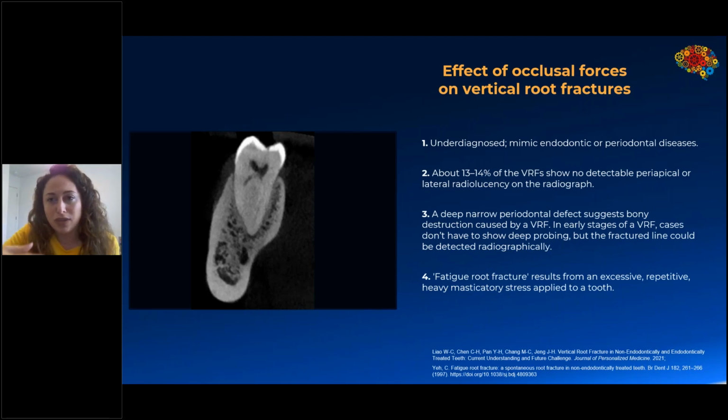And I think it's important to use a CBCT scan, especially if you don't have any implants around that tooth, if the tooth itself is a virgin tooth, to help recognize any fracture that extends beyond the CEJ. Because a lot of times patients come in feeling that pain the same day or next day after a certain incident. So I just bit on a popcorn kernel, or I just chewed an apple, or I got one where he fell on the floor.